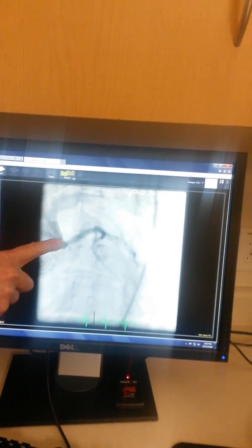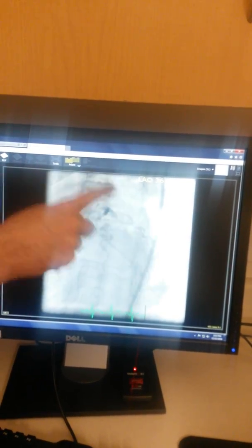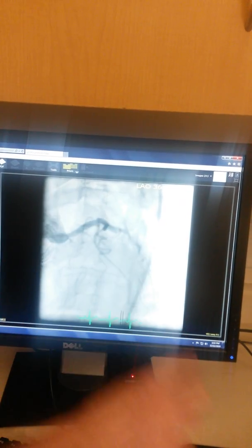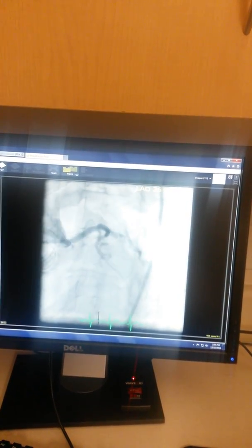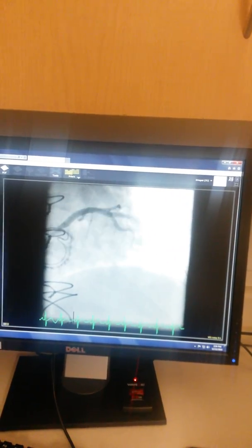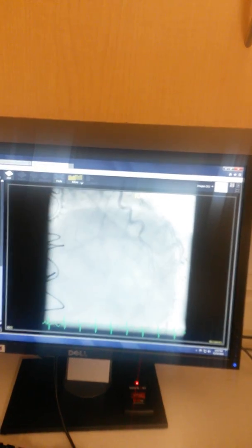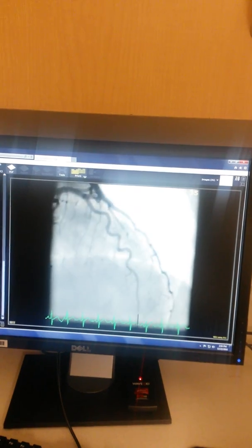Here's my catheter coming down into the left main, and you can see that the vein graft doesn't really want to fill backwards because there are tight areas of narrowing through here. But once we got the stent in there, now all of a sudden — look at this, look how quickly that fills — everything fills back. The vein graft fills all the way back here up to the origin; it comes out the aorta now.